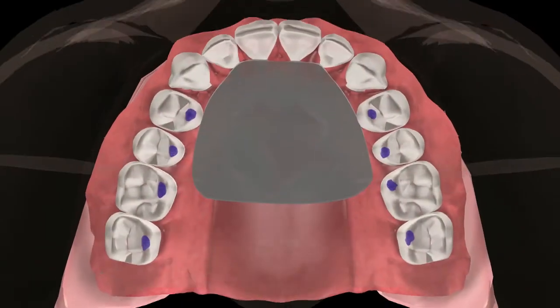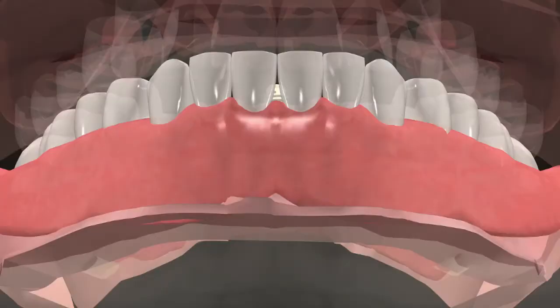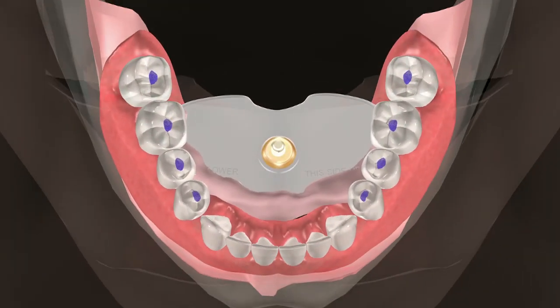In a Class I occlusion, the final markings will be seen to display centric contacts on the lingual cusps of the maxillary teeth, as well as the central fossa contacts on the mandibular teeth.